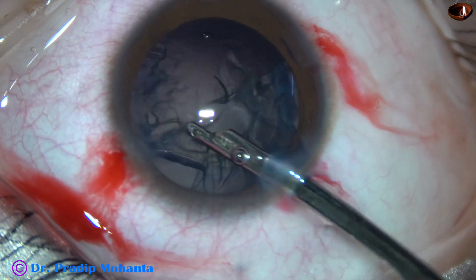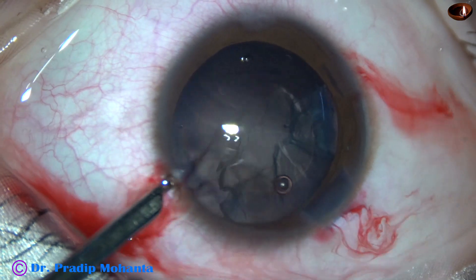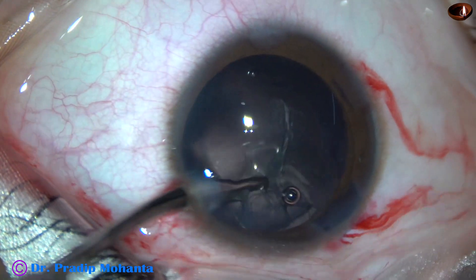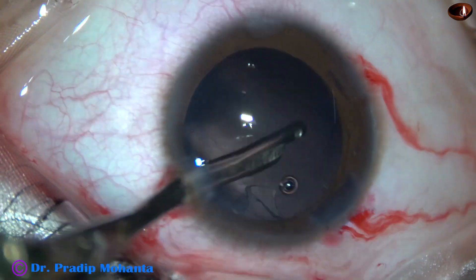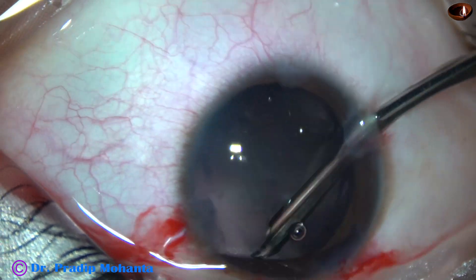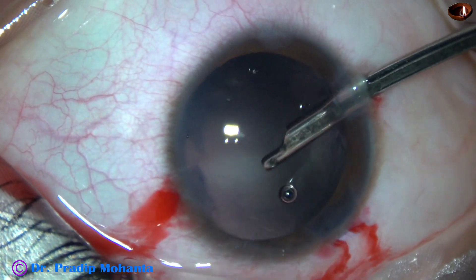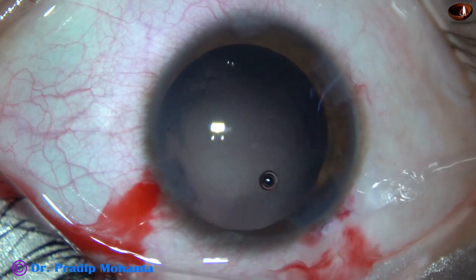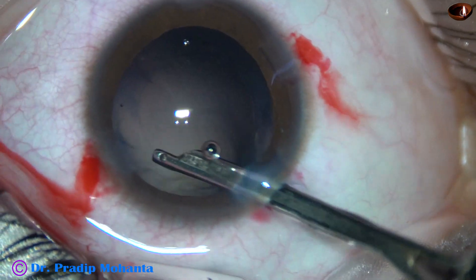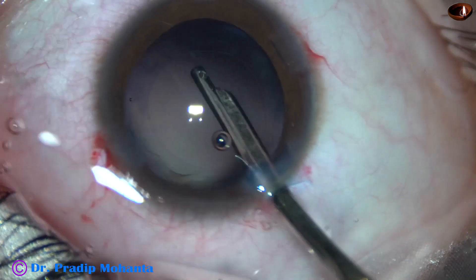We can use bimanual irrigation-aspiration cannulae as well. This instrument works very well in all kinds of cases. I go through the right side port and remove the cortex from 1:30 o'clock, then remove some lens fibers sticking to the posterior capsule. Going through the main incision, I remove some lens cells as well as from the undersurface of the anterior capsular rim and get a nice polishing.